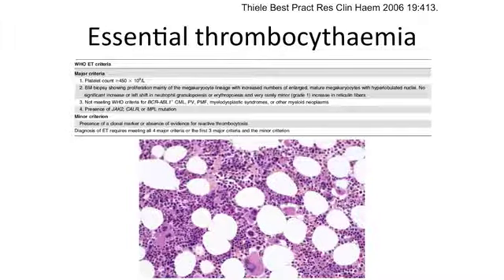This is essential thrombocythemia, so I hope that by seeing the two photos in rapid succession, you can see that here we have much more fat and less cellularity. So this is a normocellular marrow, and the numbers of megakaryocytes, which I don't know if I can get my pointer there. Let's see. So here is a small cluster of megakaryocytes down here.